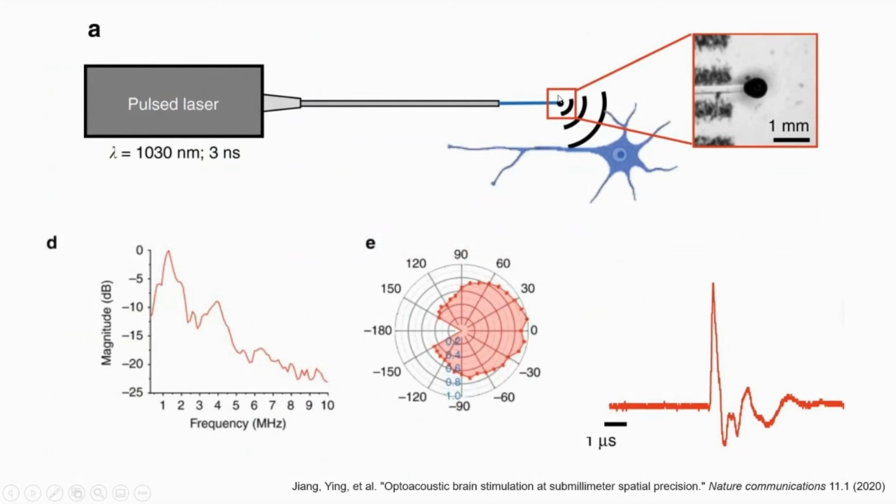optic cable, and he coats the end of this fiber optic with 2 layers of an epoxy laced with graphite. Essentially, when you pulse it with a laser, you heat up these layers differentially, and this fast expansion and contraction creates displacement. So you can imagine this thing blowing up a little bit and displacing the water around it, and when you shut the laser off, it quickly shrinks back.